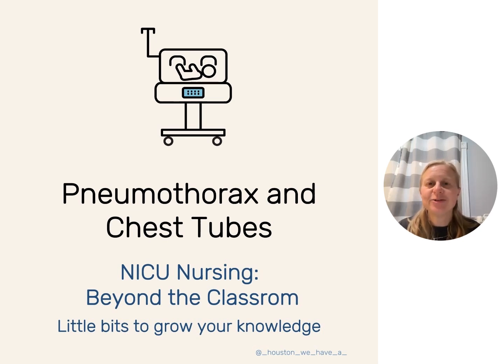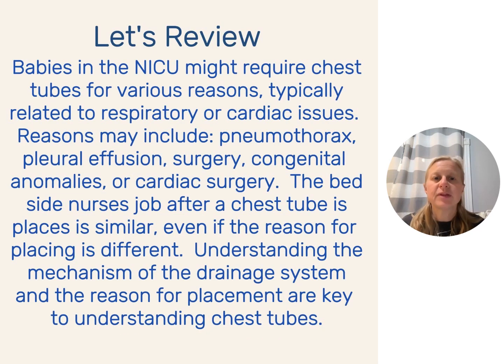My name is Lisa Houston and I am a clinical nurse educator in the neonatal intensive care unit. And today I am here to talk about chest tubes and pneumothorax, what a nurse's role is in taking care of a chest tube and all that fun stuff. So let's get started. Babies in the NICU do require a chest tube for a variety of reasons, right?